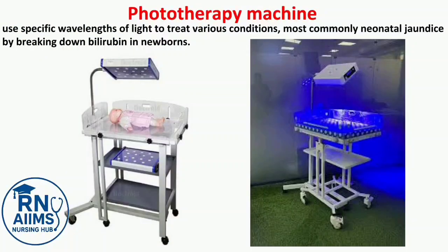Phototherapy machines use specific wavelengths of light to treat various conditions, most commonly neonatal jaundice by breaking down bilirubin in newborns.